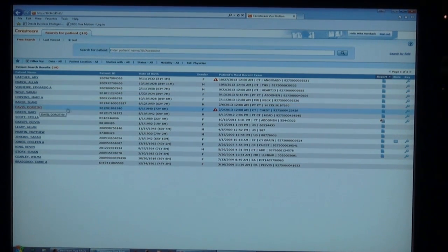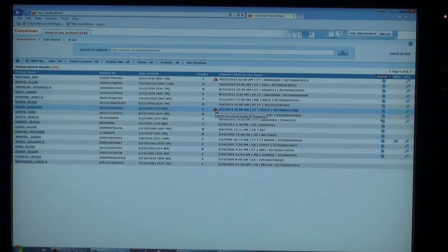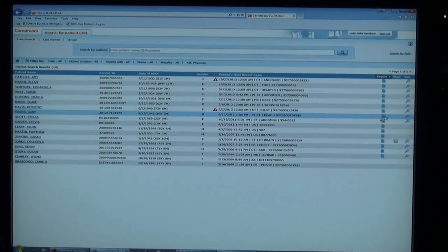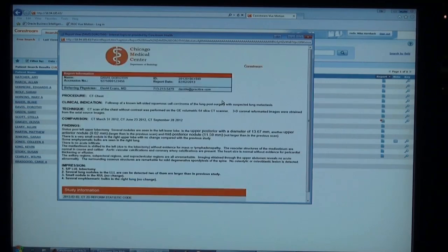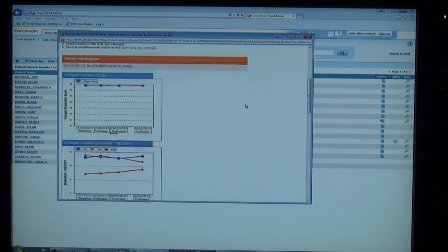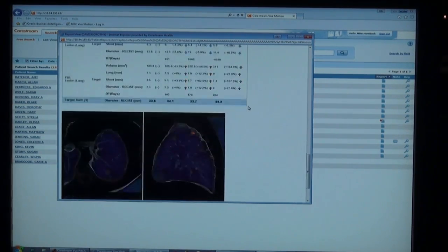Once they find their patient, they'll find basic patient information, indicators of critical results if they're used in ViewPACS, as well as the report. If they simply want to see the report, they can click the little piece of paper, and up comes the report, which can include analysis and key images.